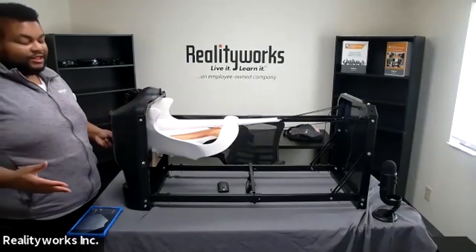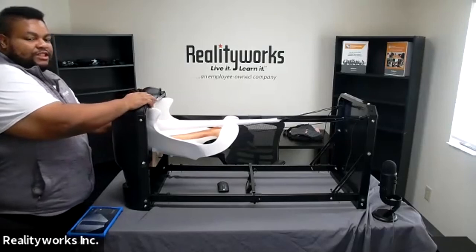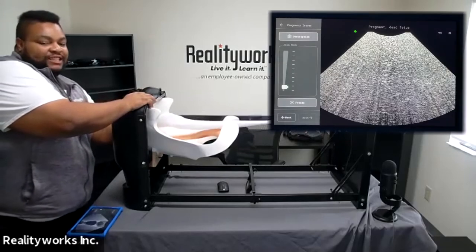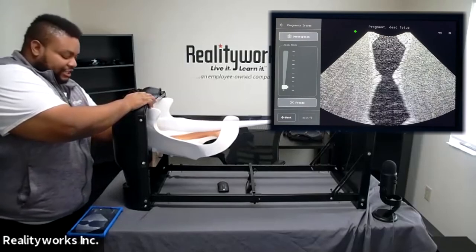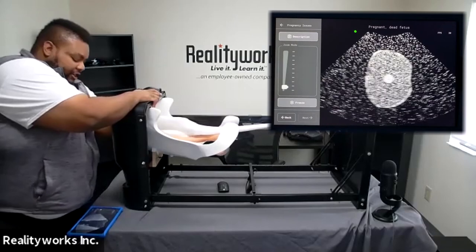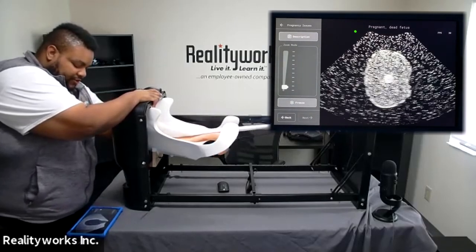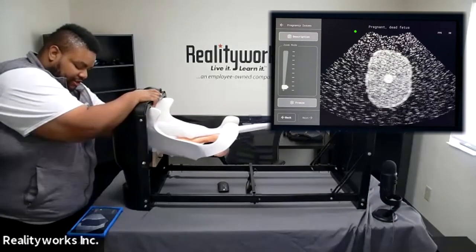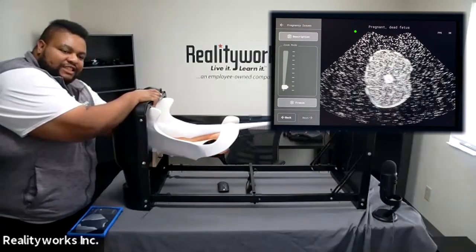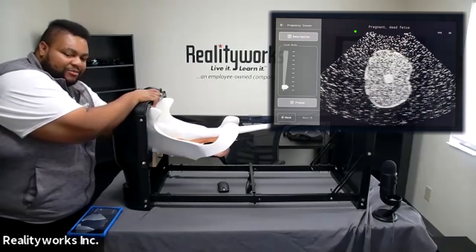Going through that one more time: take the probe and as you slide down the uterine track, the probe will pick up the different sections of the reproductive tract. Once you get to where you're looking to be, look for the fetus. In this scenario, once you're in the right position, you'll see there's a pregnancy issue and the fetus is dead as it has no heartbeat.